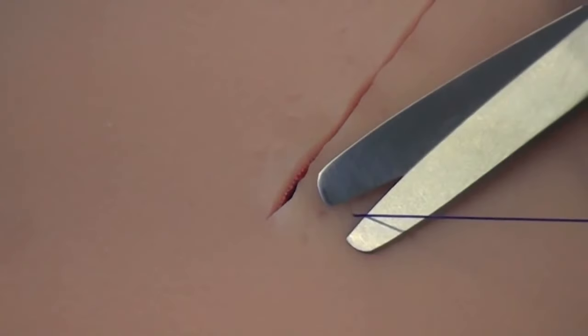The thread ends are then cut short. In the layer above the subcutaneous suture, the skin is closed with a single interrupted suture, or alternatively, with an intracutaneous suture.